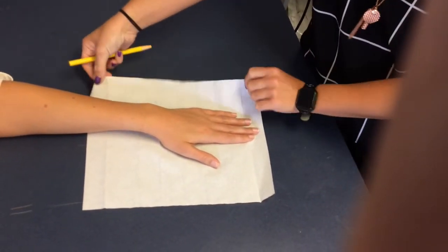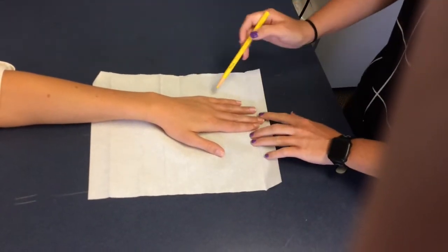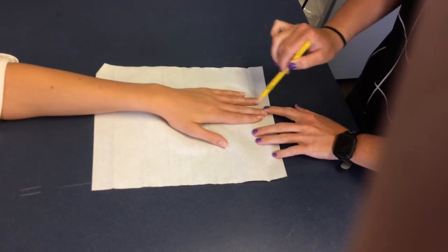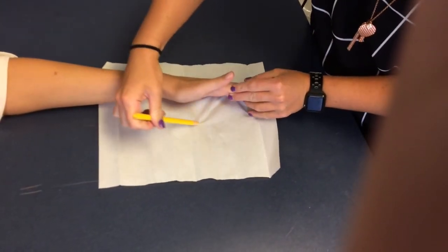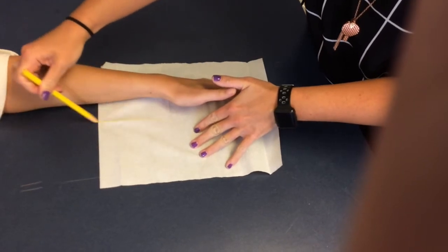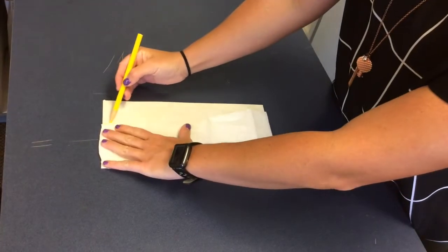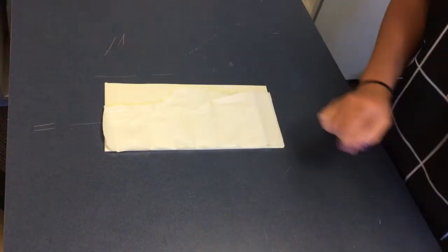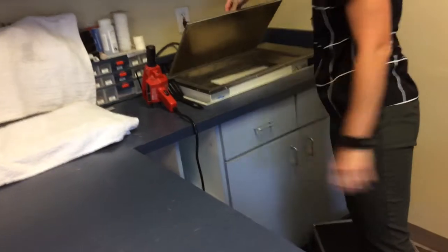Start by either tracing the patient's hand onto a paper towel and then tracing it onto the thermoplastic, or you can use a pre-made pattern. If you are tracing the patient's hand, you want to make sure that you are starting at three-fourths of the proximal forearm and including the ring and small finger in your pattern. Once you are done tracing your pattern, you can put your thermoplastic into the hot water so it can heat up.